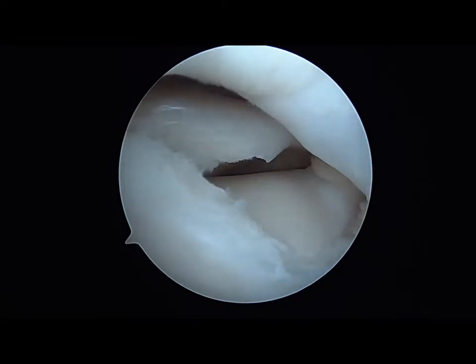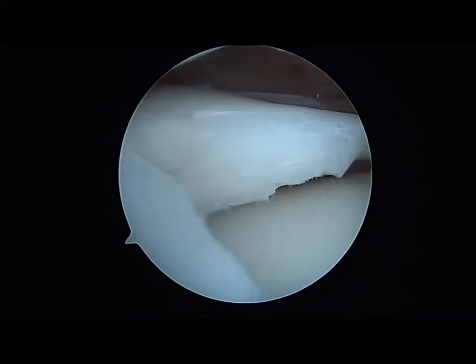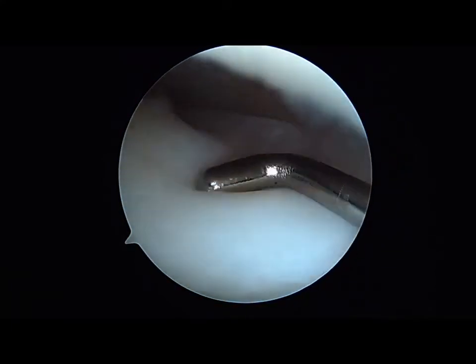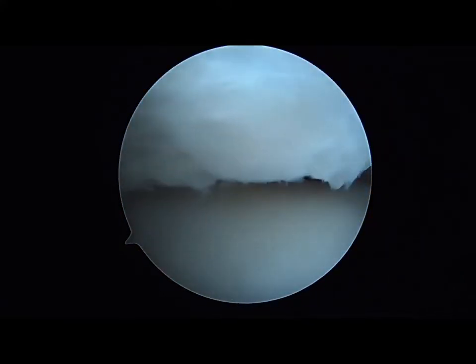Probing of the mid-substance of the meniscus after the initiation of saucerization is performed to allow for the assessment of delamination, and a 5 mm probe is held vertically along the medial edge of the meniscus post-saucerization to allow for peripheral height and thickness assessment.